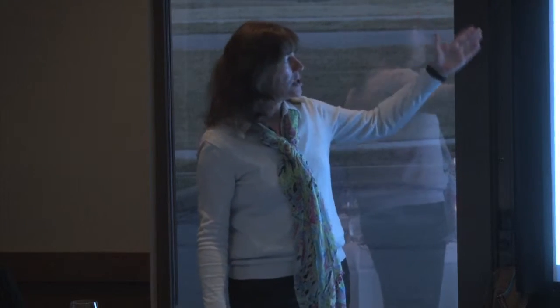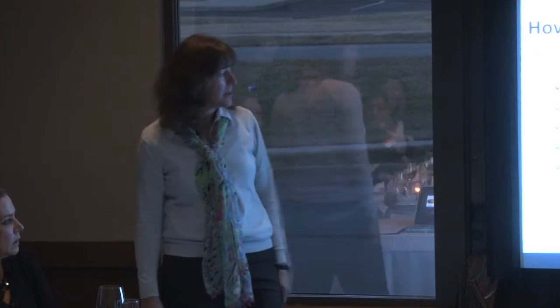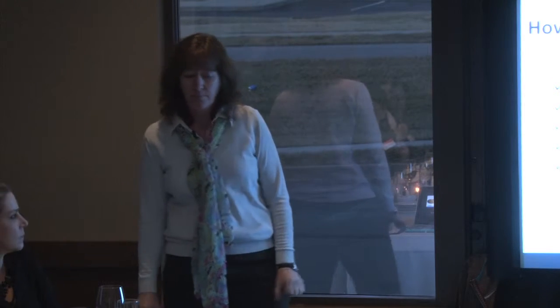So, how do we determine an occlusion? What are the potential indicators of a catheter occlusion? Well, it says here: inability to infuse fluids, lack of free-flowing blood return, increased resistance when flushing, sluggish flow, and how about those frequent infusion pump alarms?